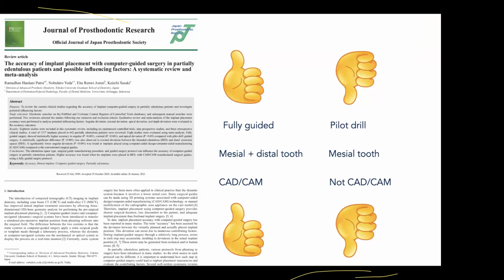Навигационная хирургия может вам позволить создать шаблоны под все этапы сверления. Но у вас может быть более укороченный протокол работы, например, вы будете использовать одно, два или три первых сверла, пилотное сверло, то есть не по полному протоколу идти.